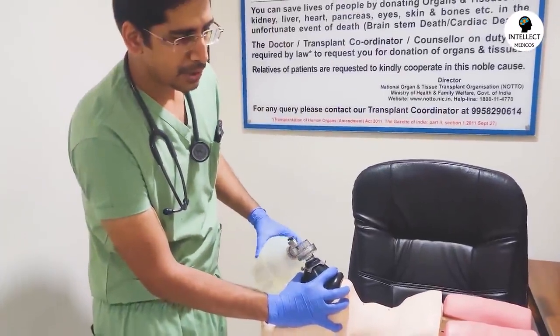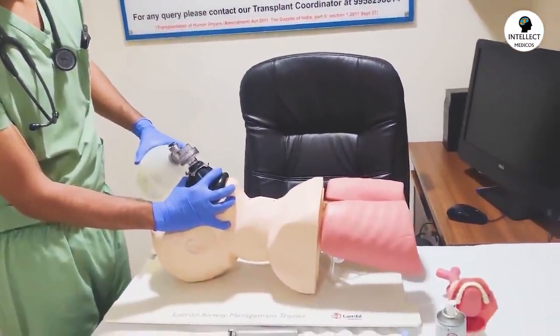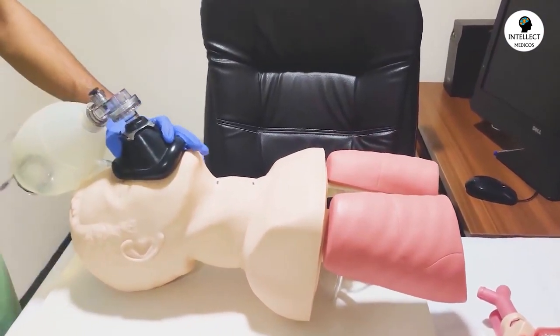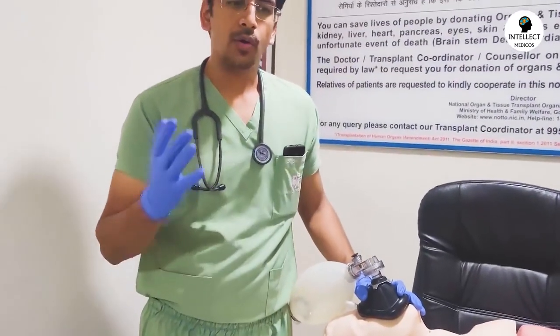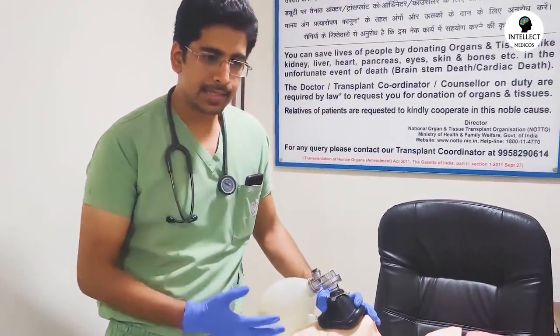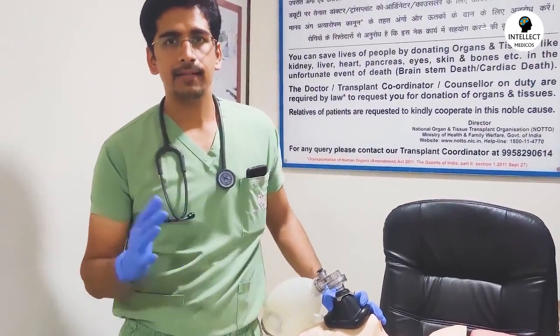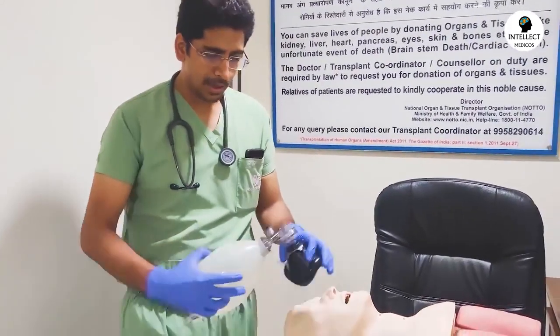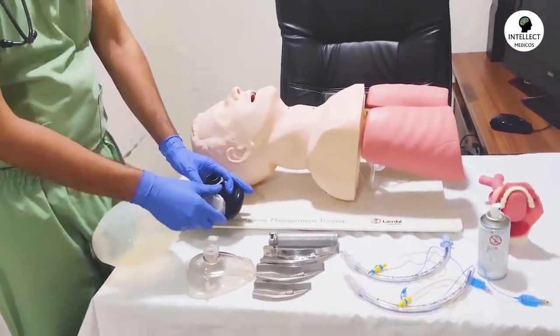And then with the other hand, you have to inflate. You have to give the breath to the patient. As you can see, the lungs are inflating, right? So this is how you do a bag and mask procedure. Whenever you are giving medication to a patient, till the time the patient is anesthetized and relaxed, you need to give bag and mask. Now coming on to the other equipment.